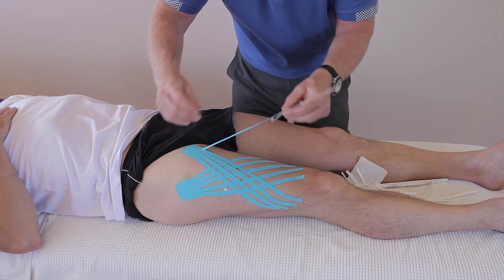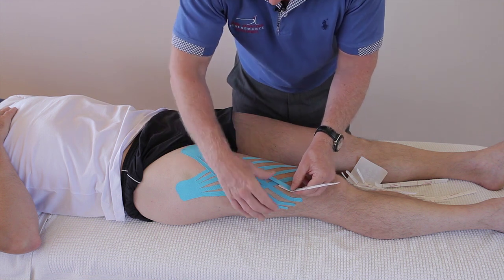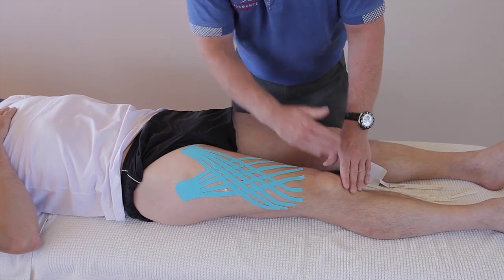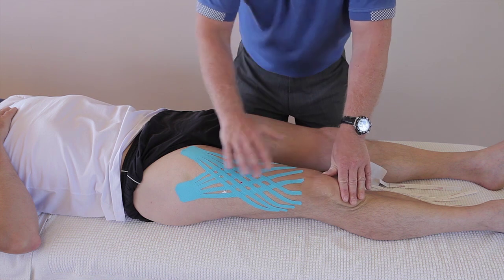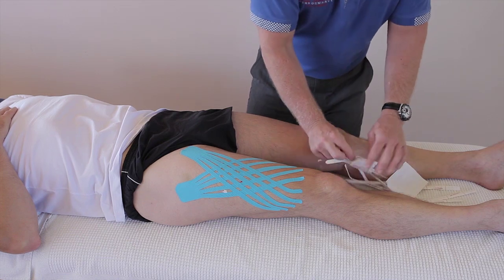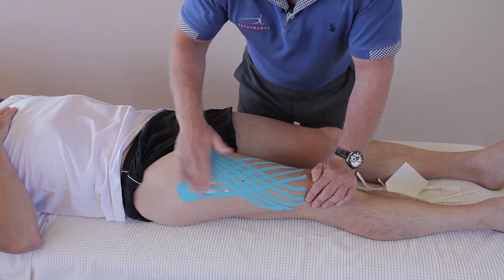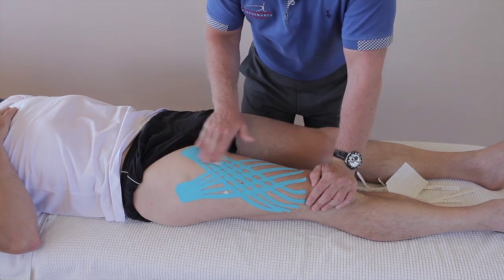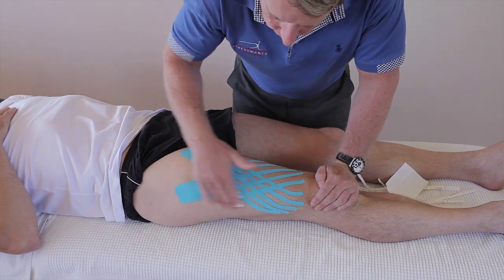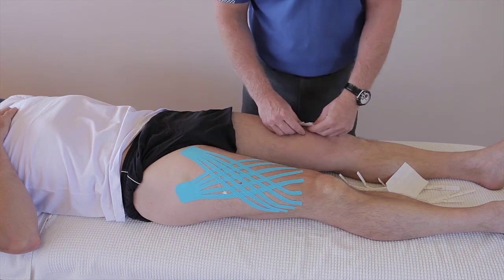So this would be two bits of tape applied directly over it, but you can also put another one there and come over it — it depends on how much of a hematoma you've got. Using the back of the tape, just heat activate the glue. Be careful with the patient because it might be a bit painful. And that should help reduce the swelling.